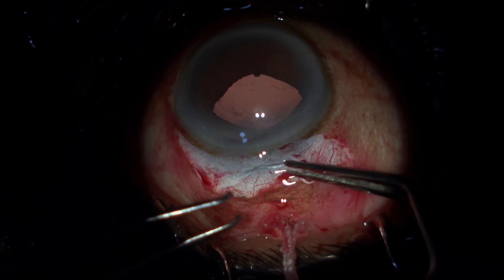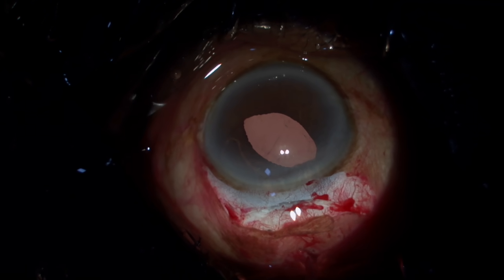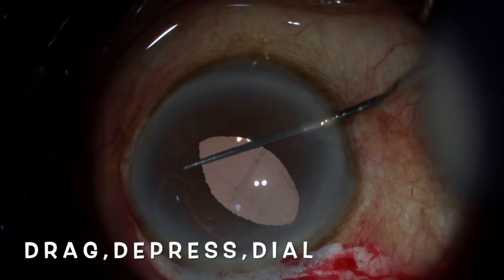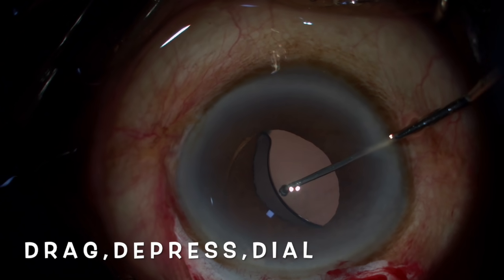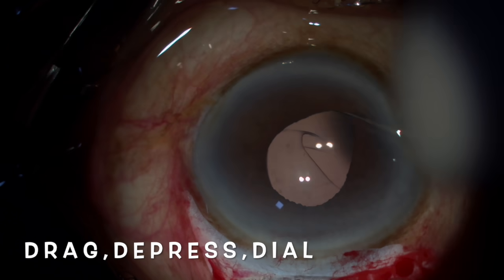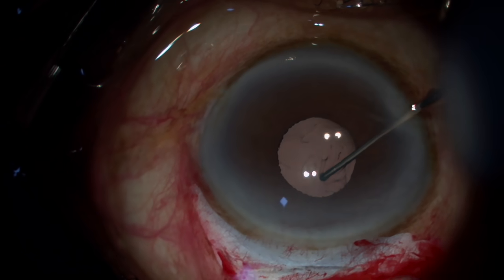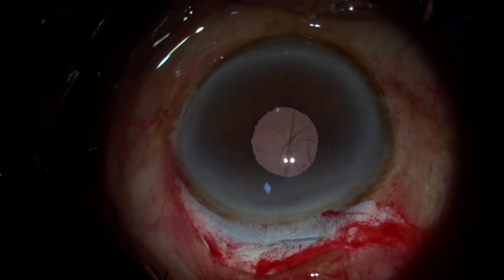Once I lift the trailing haptic up and it goes in, I just position it. Now I use three important D's — drag, depress, and dial. I use this for all my lens dialing, always going through the side port. Hold the dialing hole, pull towards the center, drag, depress, and dial it — and in one go you have the lens inside the bag. This technique can be used even for foldable lenses, where you hold the optic-haptic junction instead of the dialing hole.